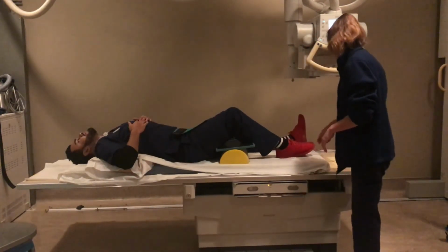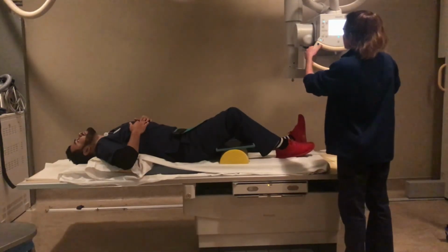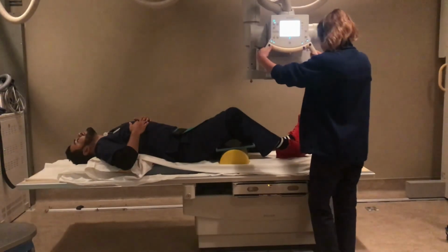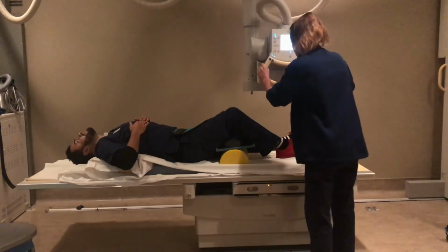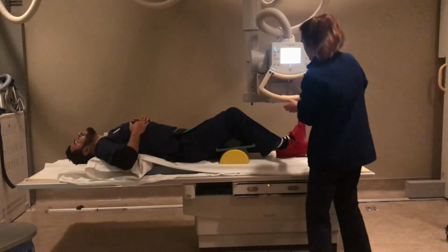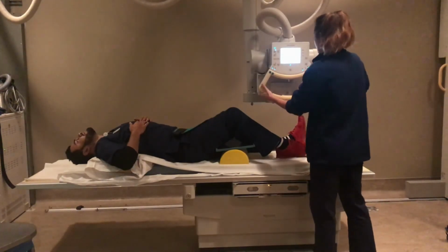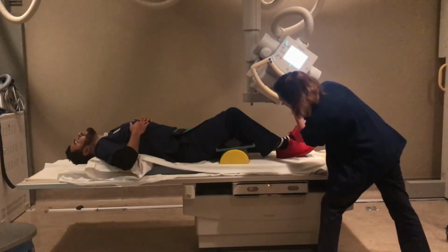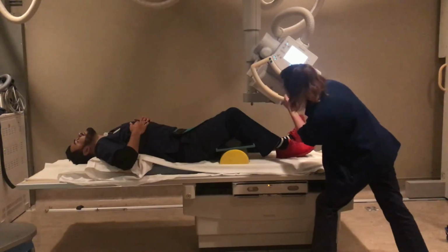So the knee is flexed at 60 degrees. And the CR is going to be angled to the lower limb. Like that.